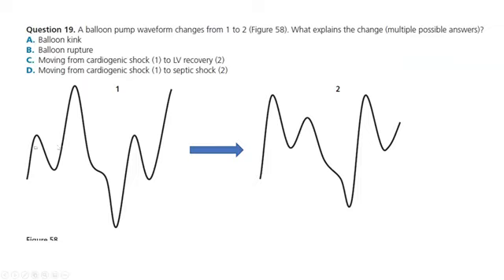Look at that pulse pressure between the two beats. This is the pulse pressure of a failing heart. It's small, and you're getting a big augmentation. This is a big pulse pressure. It's not a pulse pressure of a failing heart, and maybe that's the problem.